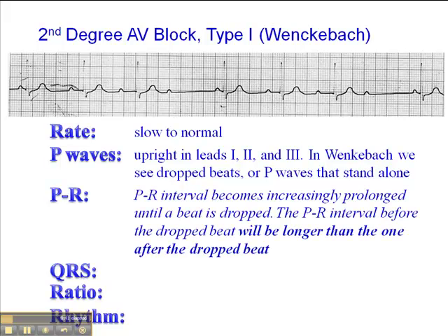The other key finding in a Wenckebach is that the PR interval becomes increasingly prolonged until a beat is dropped. This is the most common type of Wenckebach or 2nd degree AV block type 1. The key to interpretation is that the PR interval before the drop beat will be longer than the one after the drop beat.